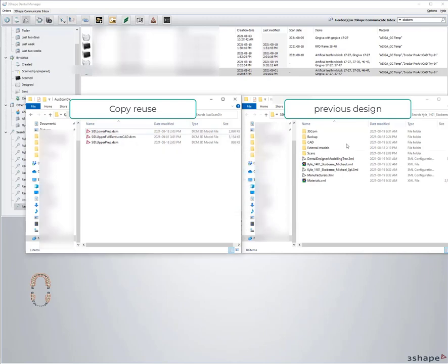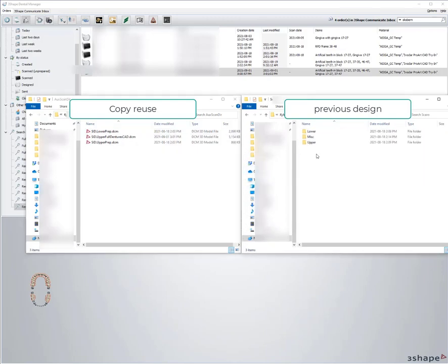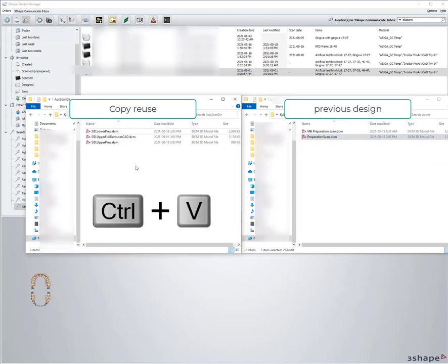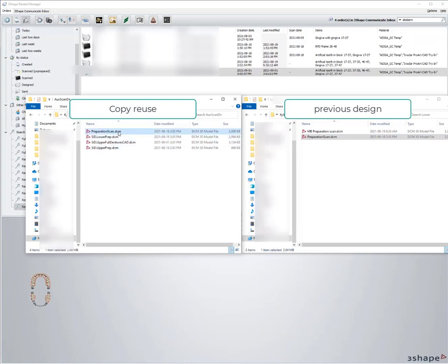Then I'm going to go into my previous design scans, find the lower model scan, hit Control C to copy and then Control V to paste in the copy reuse CAD one.